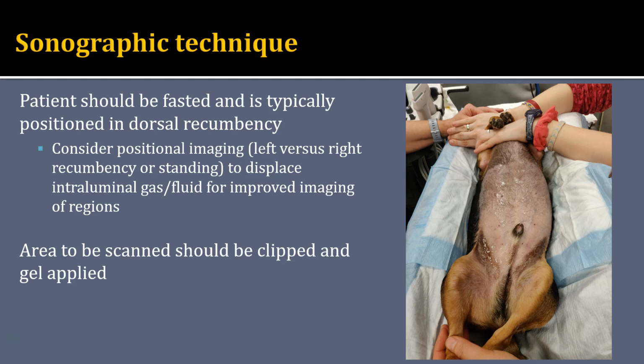I also would like to consider sedating the patient if I'm not looking for GI motility. Sedation allows the patient to not be anxious and to relax, and allows for a more thorough examination of the GI tract. For most of my abdominal studies, I want to put my patient in dorsal recumbency like our example patient on the right of the slide.